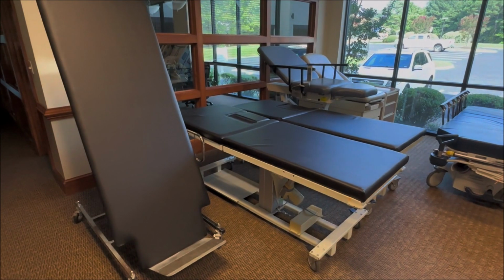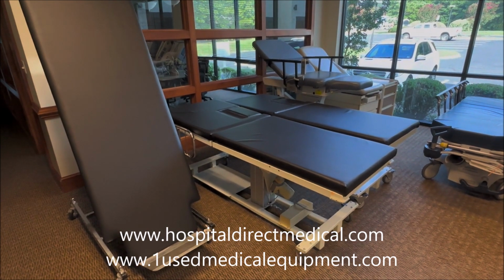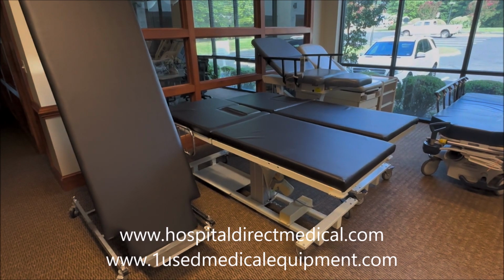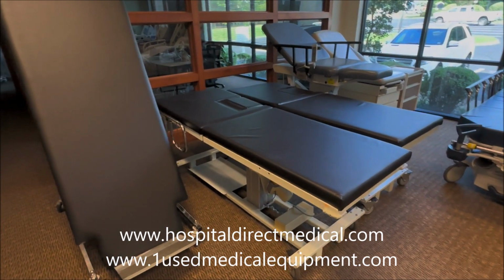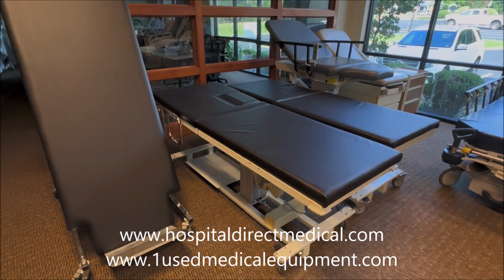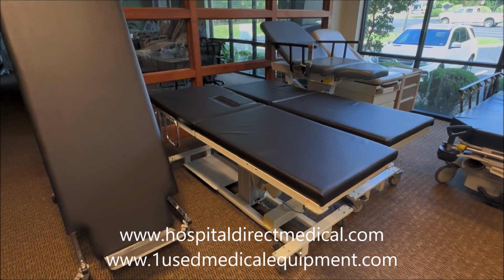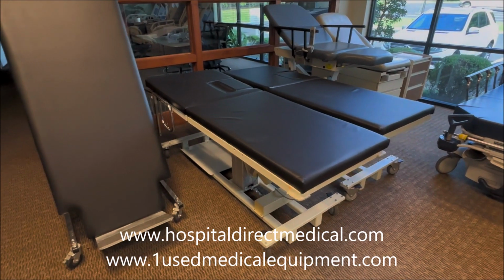We're at USA MedBed Hospital Direct Medical, and we're looking at the difference between a vascular ultrasound table and a cardiac ultrasound table. We get this question a lot, and it's a popular question. I've had many purchasing people in medical facilities not know the difference, order the wrong table, and then all of a sudden the staff is not getting what they need. So this will be a real quick overview.